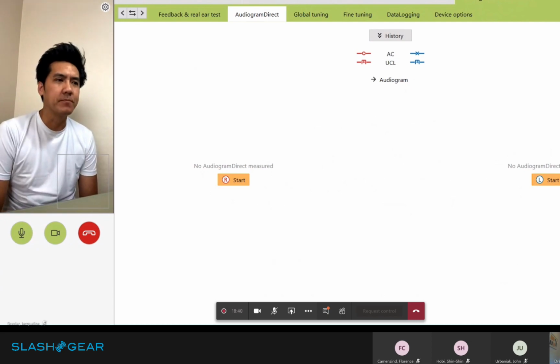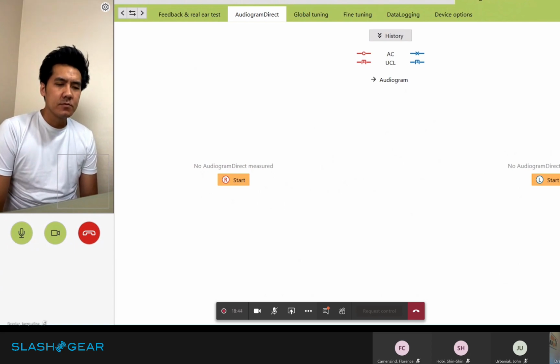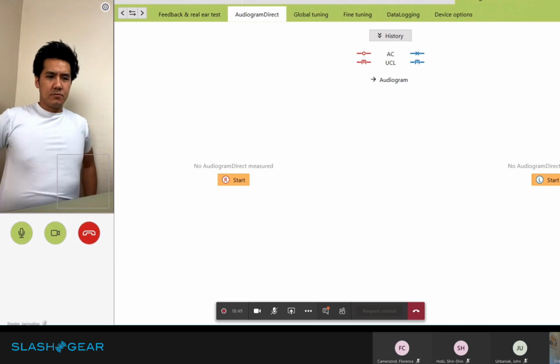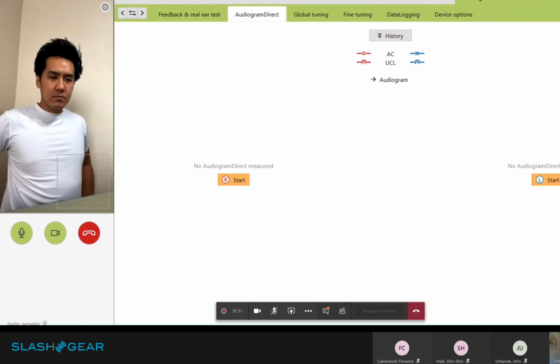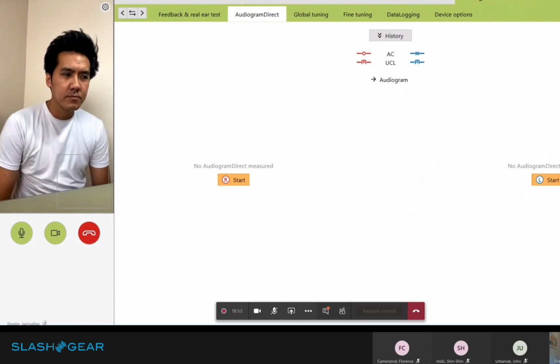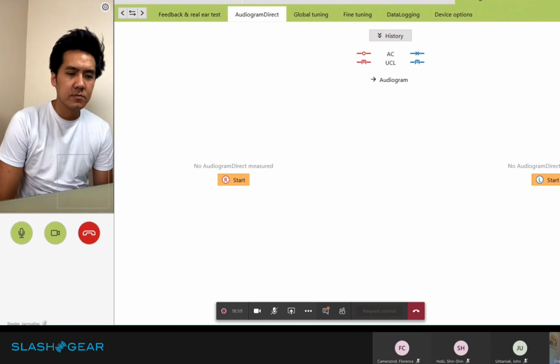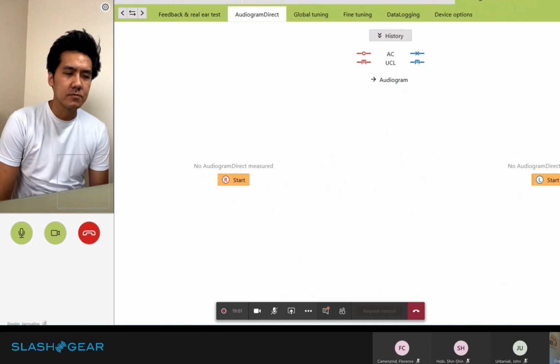So okay. The diagnostic test battery is looking at the whole hearing system. It's taking a look at different parts of the hearing pathway to determine where in the hearing pathway you are having issues with the hearing, to determine which part is looking at your speech understanding. So it's a fuller picture. Okay. And then this is just taking part of that picture, and now you have the hearing aids. How does the whole system fit? And then cross-checking those thresholds. Got it.